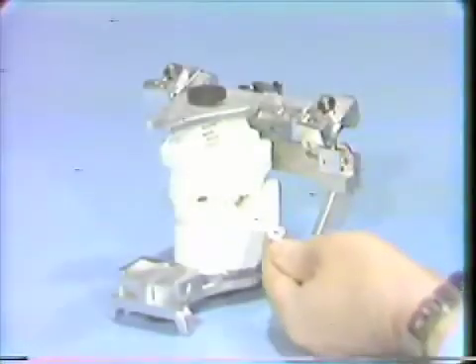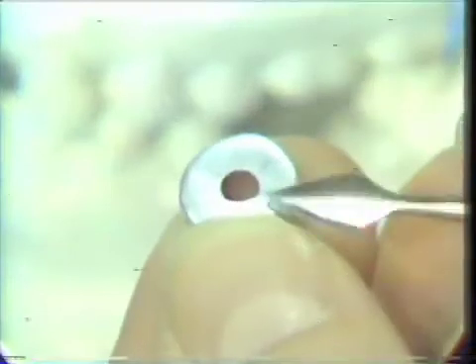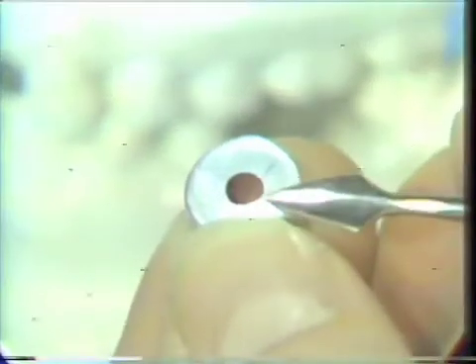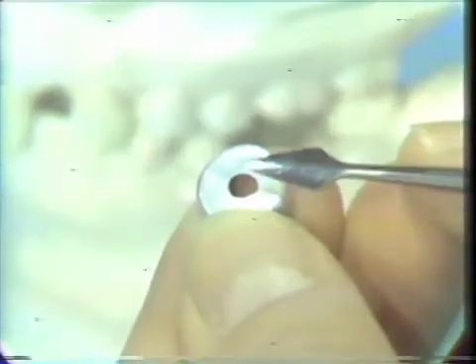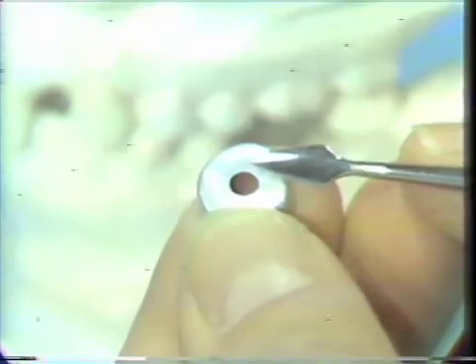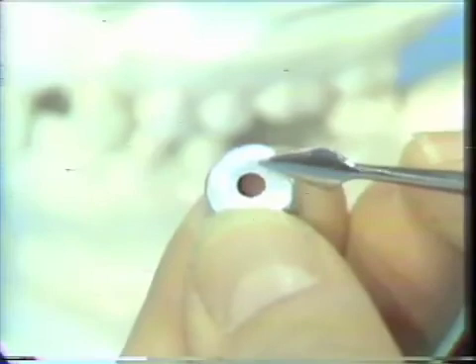A way that works very successfully with this technique is to take either a standard aluminum shell crown, as we have done here, and cut it down so that it fits a tooth well at the cervical area, and cut a hole in the occlusal surface to allow some of the acrylic to be expressed through, or to use a copper band. The hole allows us to register the opposing cusp in the acrylic material and subsequently rearticulate our casts.